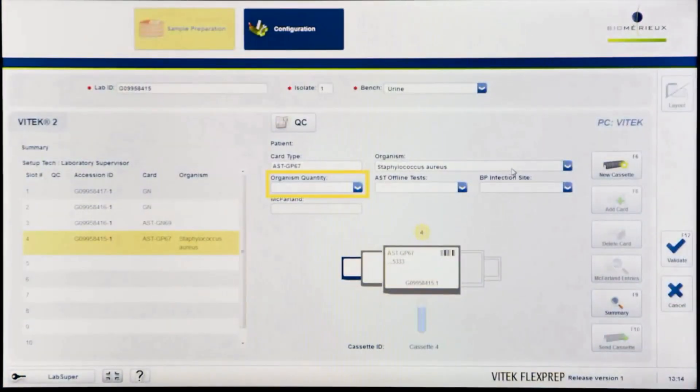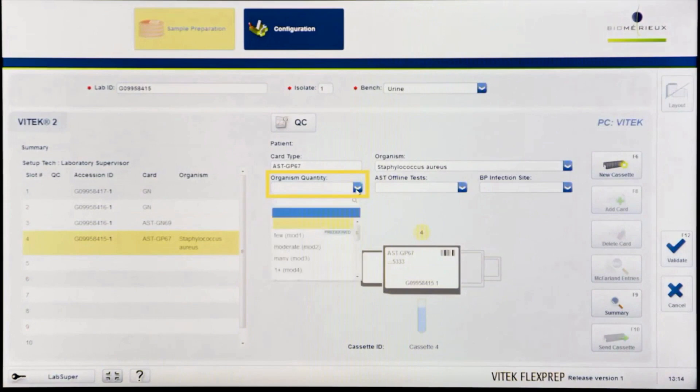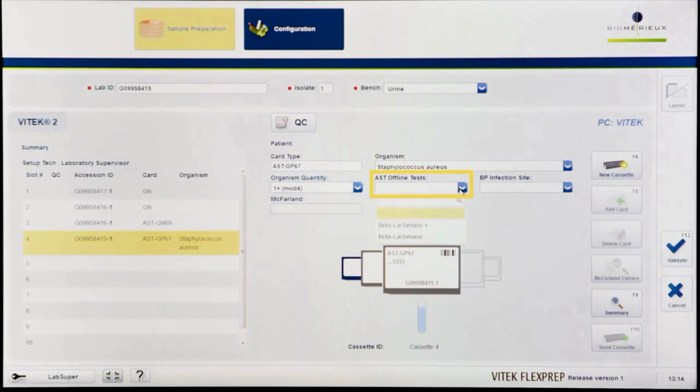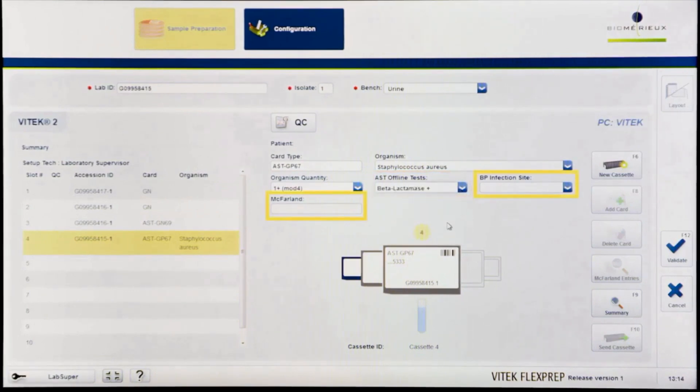Enter information for organism quantity, AST offline test, BP infection site, and McFarland fields as desired. These fields are optional.